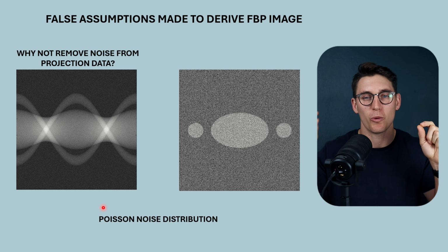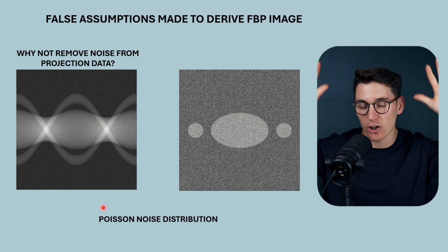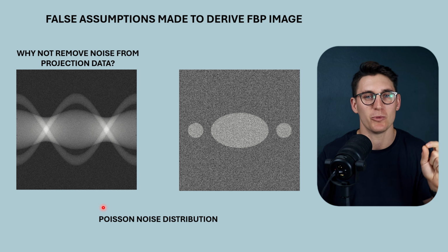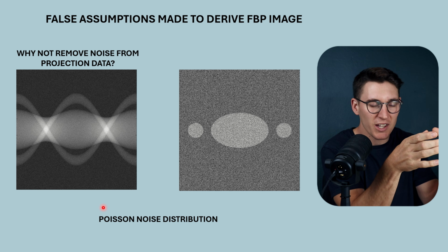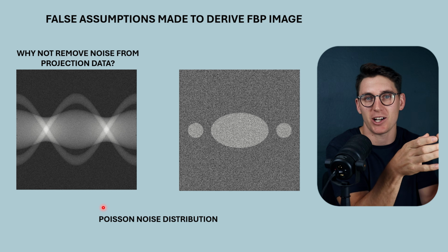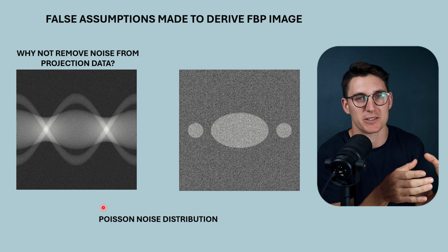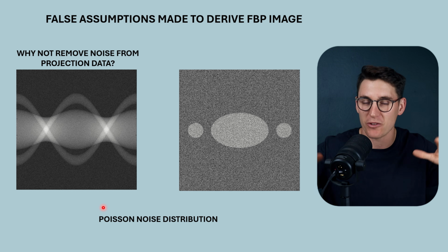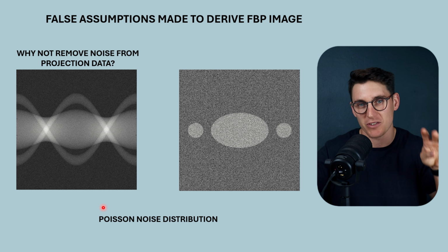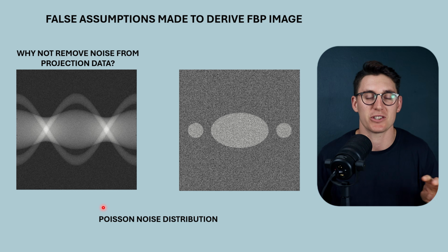It's not uniform. We haven't got that low hum that we'd have if loads of rain were coming down. It's very random noise. If I placed a bucket out there to catch the rain, it would be very hard for me to predict how much rain I would catch depending on where I place that bucket. When it's pouring with rain, that noise on top of the roof is much more symmetrical. It's much more predictable. We've got this continuous noise going on the roof.